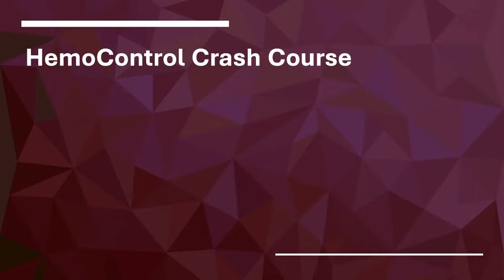Hey guys, today we're going to be discussing the enigma that is HemoControl. I have found that it can have a steep learning curve, so I'm hoping to support you guys in learning more about HemoControl, whether you're a newbie to it or a veteran. So without further ado, let's jump right in.